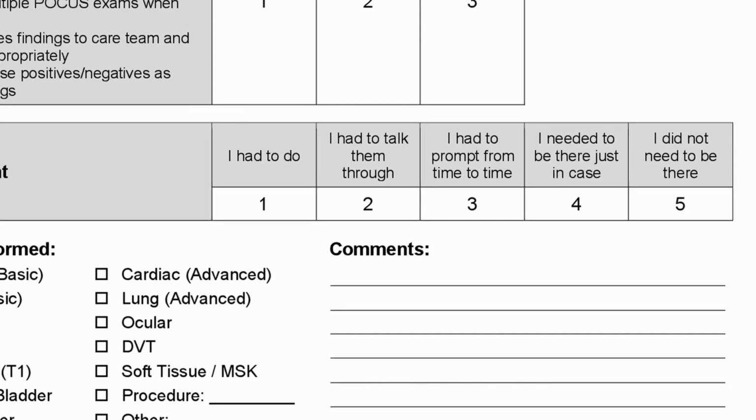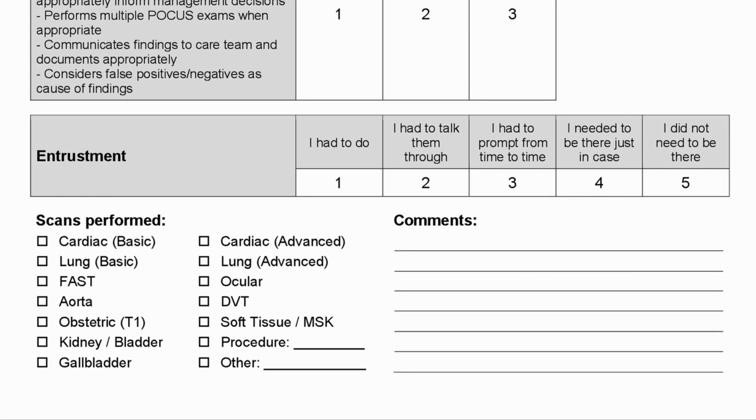At the bottom of the form, there's a list where you can check off which scans were done, and there's also a space where you can include some comments. You might include something here about what the resident did well, or write down a couple things that the resident should work on. And that's it. You can give the form back to the resident, and they'll bring it back to me.